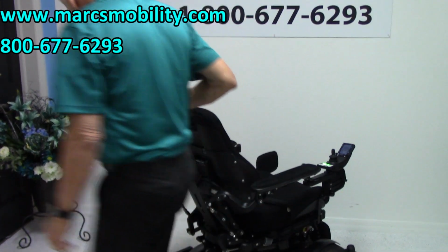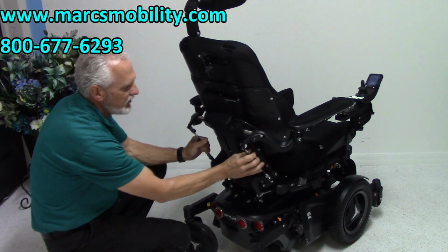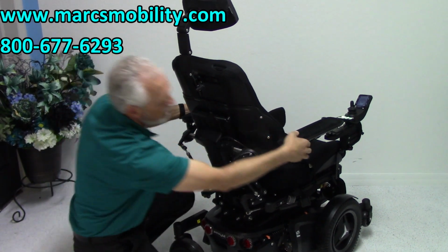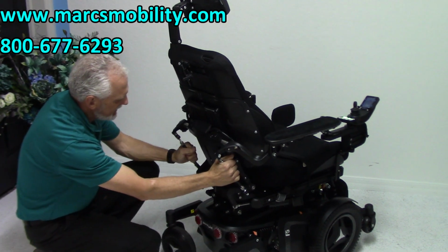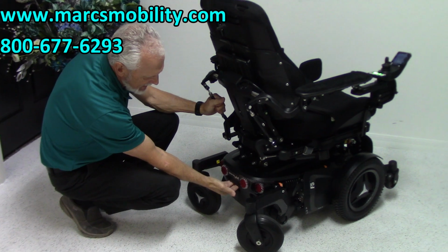Also back here, you've got 2 cylinders, and if you turn these cylinders here, it adjusts the tilt of the arm. So if you want these arms to be more like this, you would turn this and this side for that arm there. Over here, we have a power button, wherever my hand is.